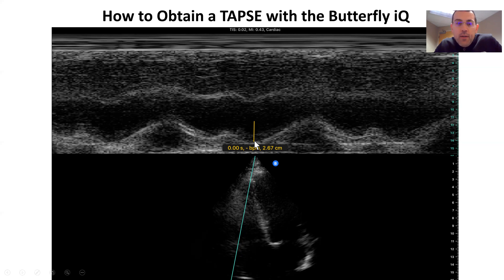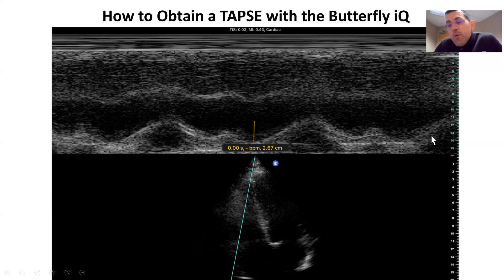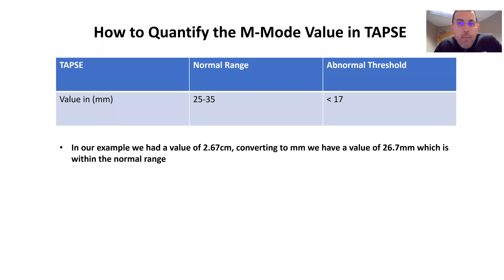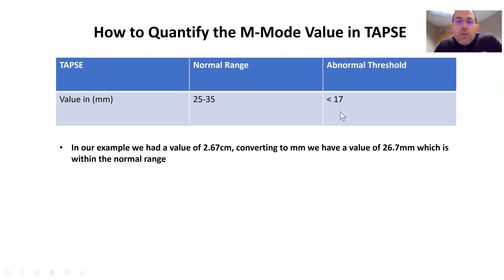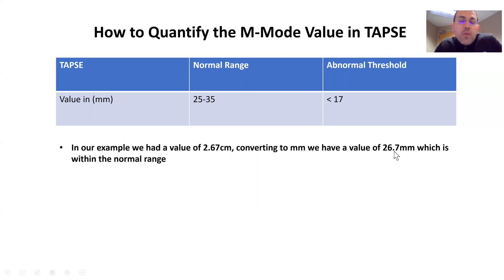So we put our calipers on. We first put our first caliper down at the trough, come across to a peak, take that across, and put the other part of our calipers up there, and we get a number. In this particular instance, we get a number of 2.67. What do we do with that number? Unlike MAPSE where the calculation can be more complicated with equations, here it's more common to look at the raw number. We simply convert it to millimeters. The normal range is between 25 and 35 millimeters, and an abnormal threshold is less than 17 millimeters. In our example, we had a value of 2.67 centimeters, which converts to 26.7 millimeters — and that is within the normal range.